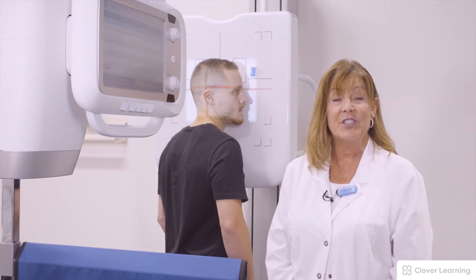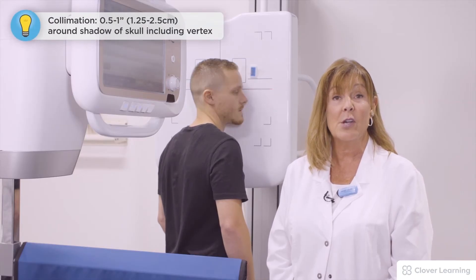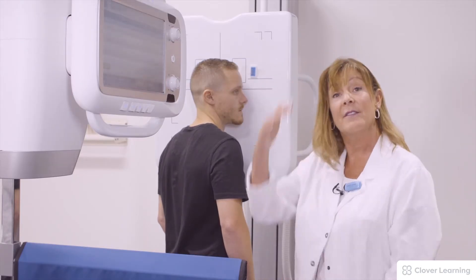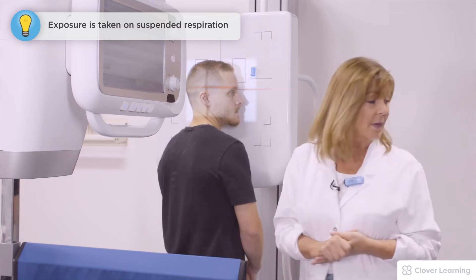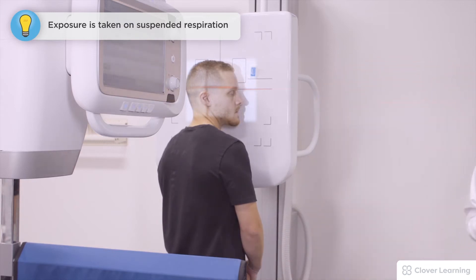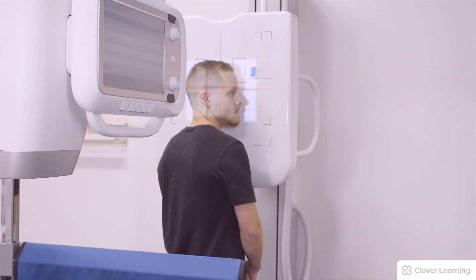The collimation is a half an inch to an inch around the shadow of his skull, making sure you have the vertex of his head included. The patient will hold very still and the exposure is made.